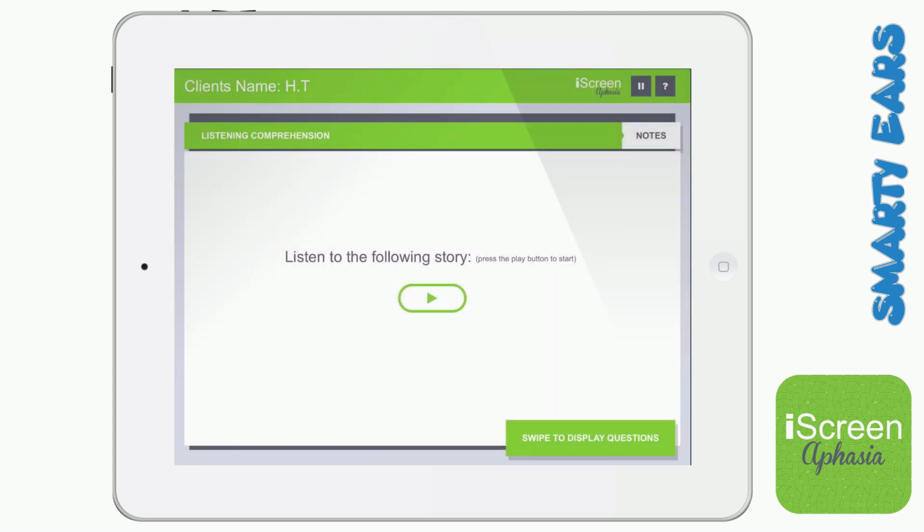Now it's time for listening comprehension. We have a story. You're going to tap play. Listen to the following story.